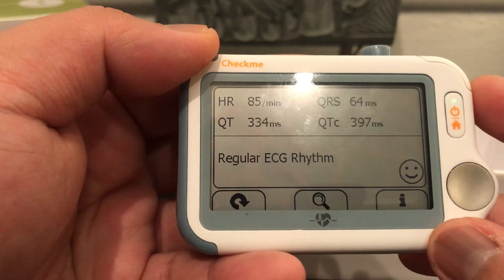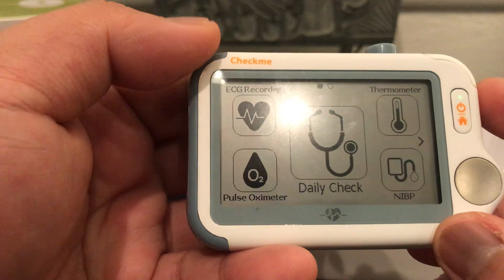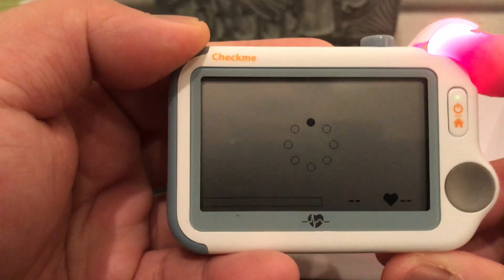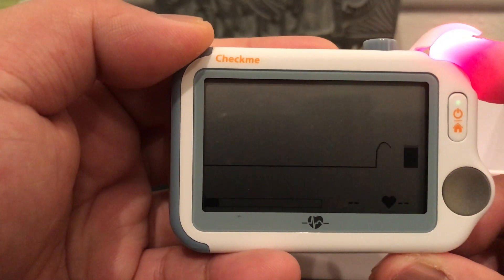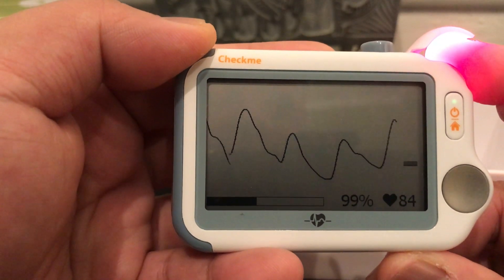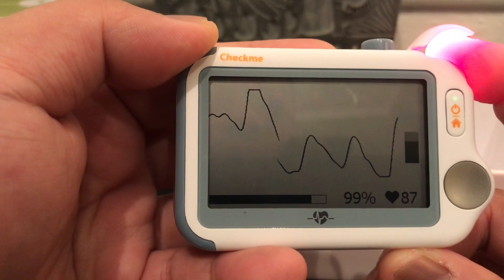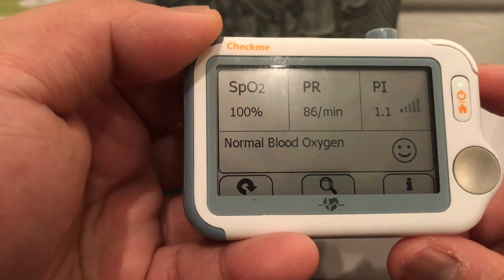Now let's look at the pulse oximeter. Click on the pulse oximeter icon, insert your finger here, and it's going to check your pulse rate and pulse oximetry. It's checking — my heart rate is steadying at 84. It's saying I have a normal blood oxygen level.